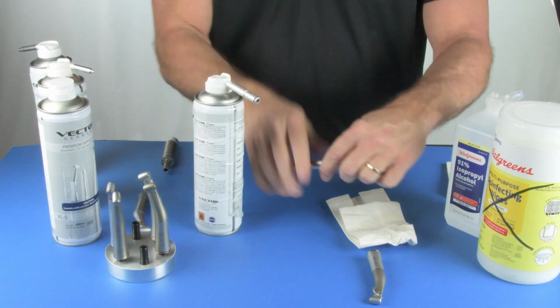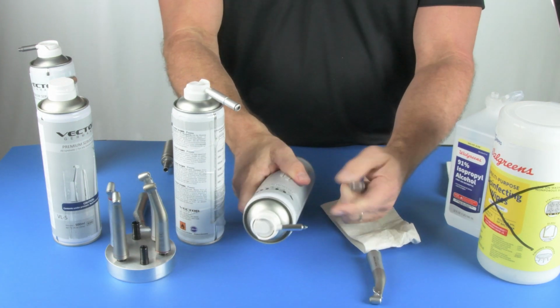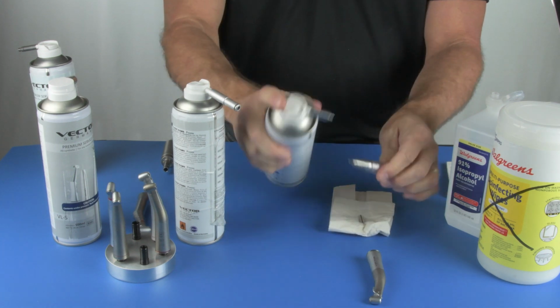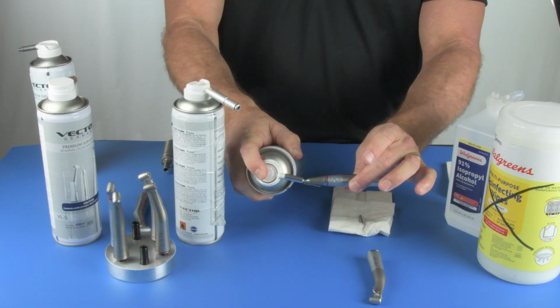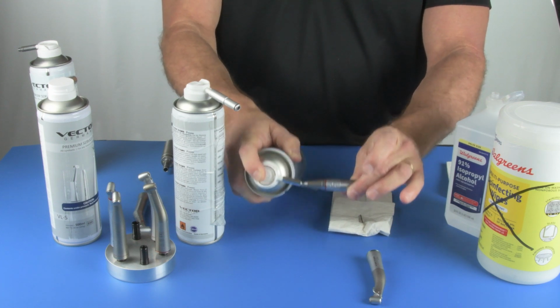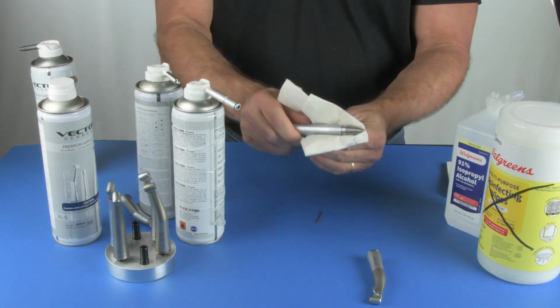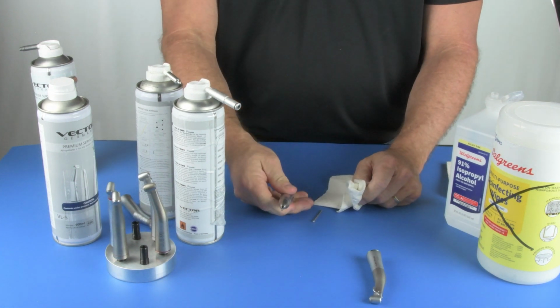After that, take the different attachment, which is a pointed nozzle attachment. It's very small, and use this to clean up into the chuck mechanism. So take out any burr, spray this again until it runs clear out of the handpiece. If there's any blood or dark liquid, keep spraying until it's completely clear. Very, very important to make these last. And then use your same alcohol 2x2 or wipe. Remove any excess oil on the outside, bag, sterilize, and you're ready to go.